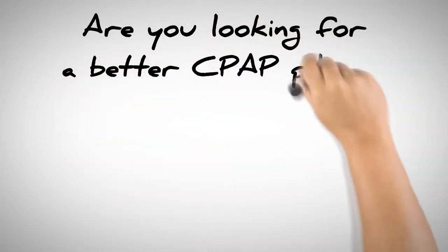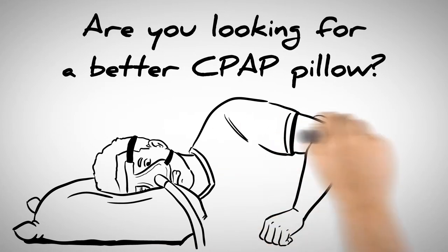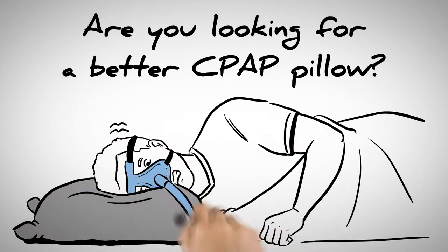Are you looking for a better CPAP pillow? Ordinary pillows knock off your mask and cause leaks, but preformed CPAP pillows are hard and uncomfortable.